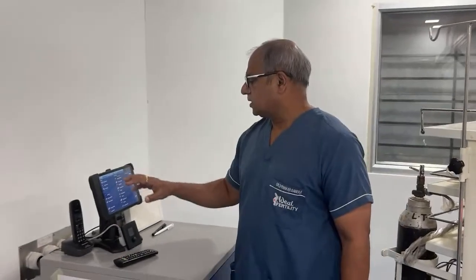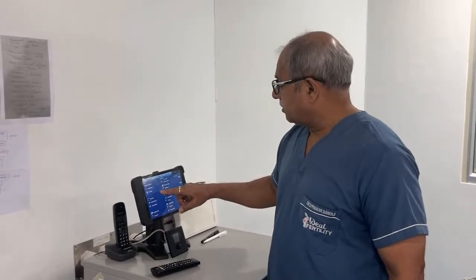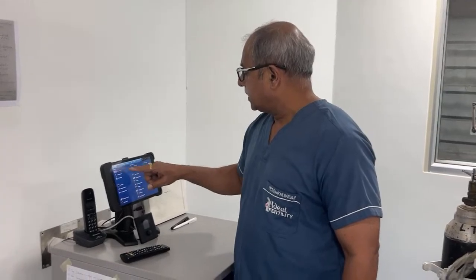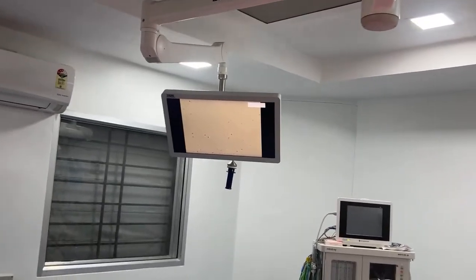Again, this is one of the very quality instruments, and if I want to show you, if the embryo room 1 is still available on my screen arm monitor, then this is the microscopic picture which is coming in.